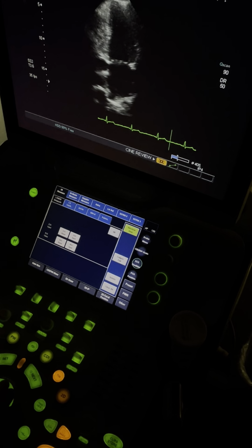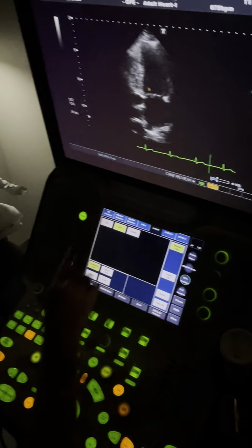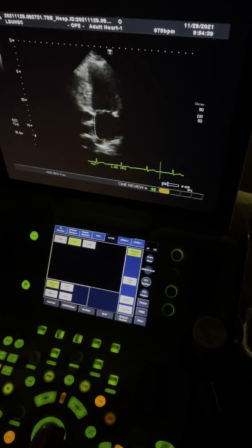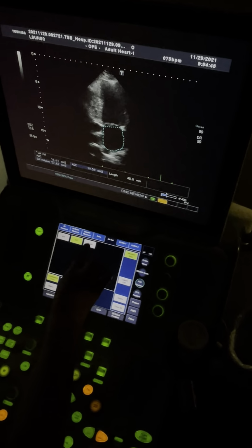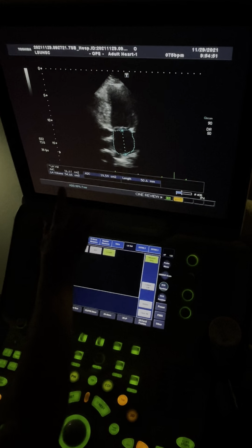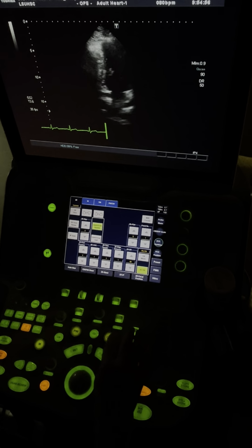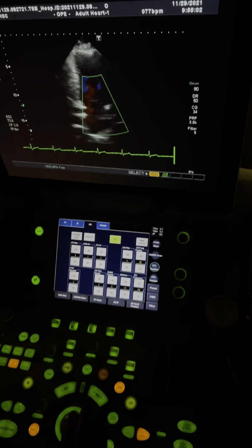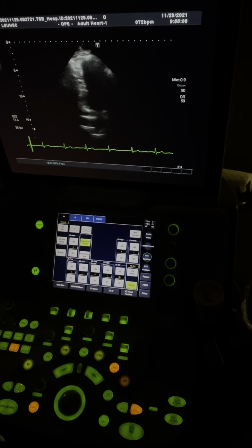Going to end systole. LA volume, 2-chamber from the apex. Don't go into the vein, come around, back to the annulus, pick a length, straight back. If I had put in this height and weight, it would have given me an index, which is really what we want. While you're here, you will want to put the color across the mitral valve and the 2-chamber. And then we rotate to the 3.